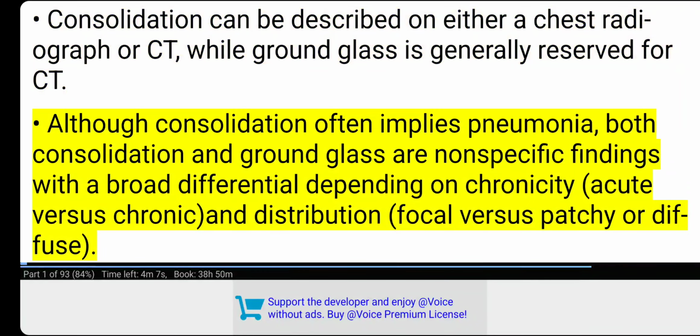Although consolidation often implies pneumonia, both consolidation and ground glass are nonspecific findings with a broad differential depending on chronicity, acute versus chronic, and distribution, focal versus patchy or diffuse.